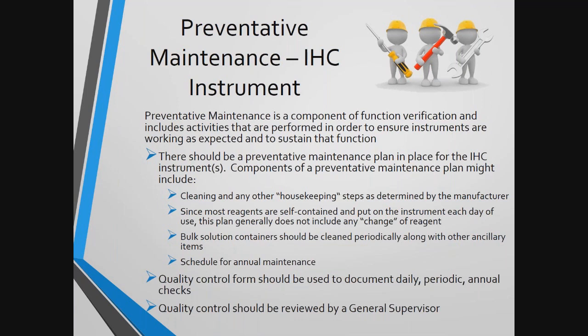All of these activities must be documented on a quality control form of sorts, because as we all know, if it isn't documented, we didn't do it. And then these quality control documents should be reviewed by a general supervisor on a regular basis to ensure the integrity and the completion of any necessary follow-up of the preventative maintenance being performed.